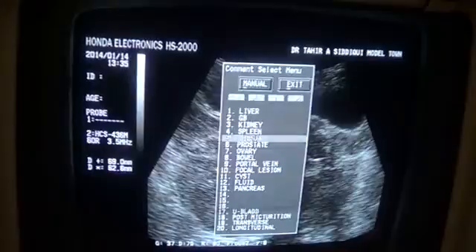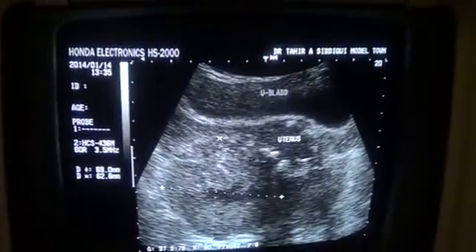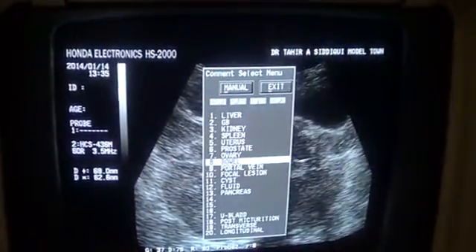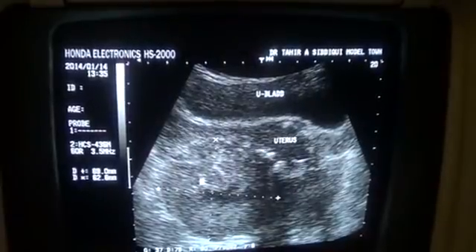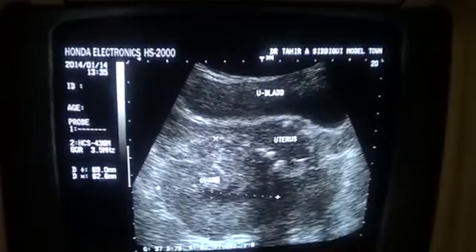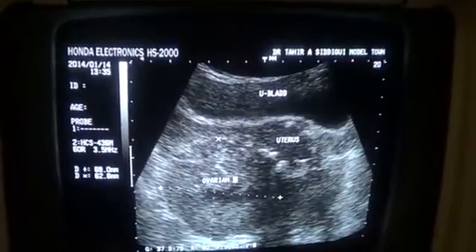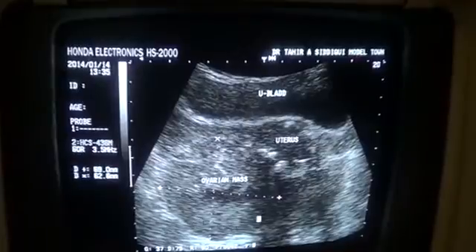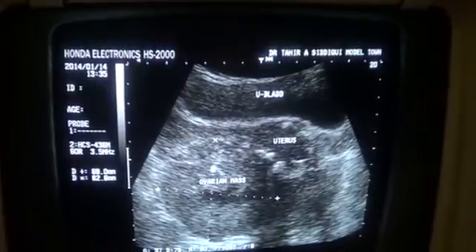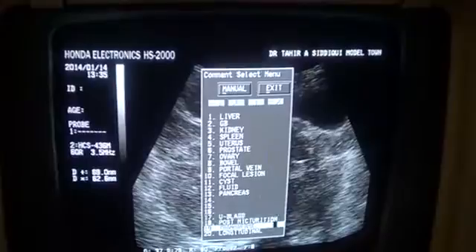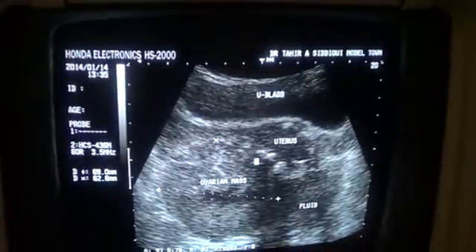This is the uterus, this is the urinary bladder, and this is the mass — a complicated right ovarian mass. It is an echogenic mass with internal cystic areas. No calcification is seen. This is the fluid within the pelvic cavity. This is the transverse section of the pelvis. Thank you very much.